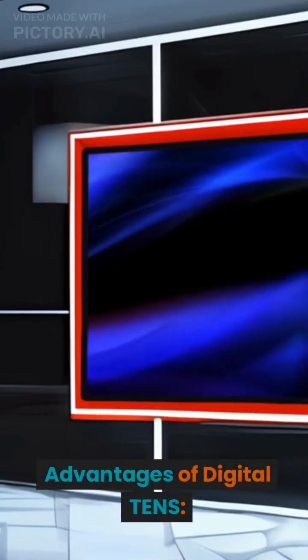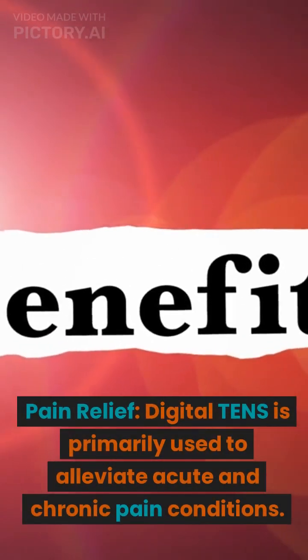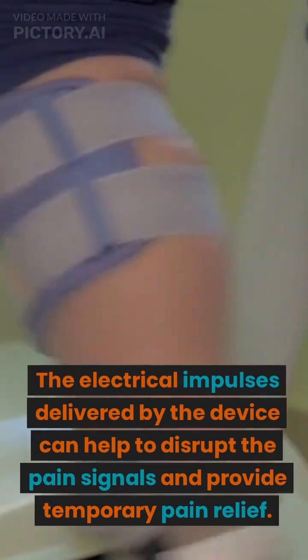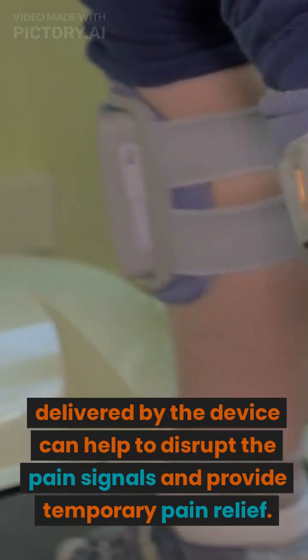Advantages of digital TENS. Pain relief. Digital TENS is primarily used to alleviate acute and chronic pain conditions. The electrical impulses delivered by the device can help to disrupt the pain signals and provide temporary pain relief.